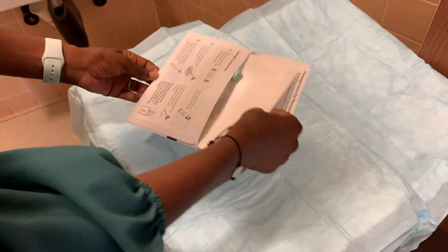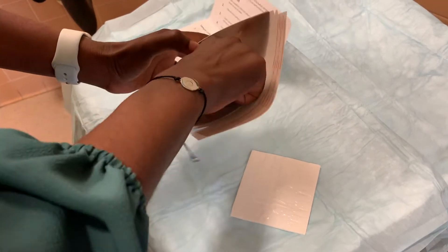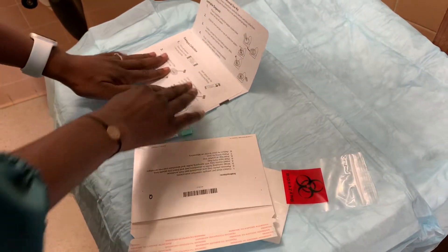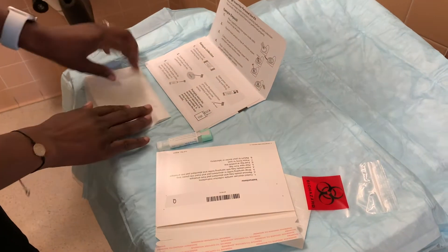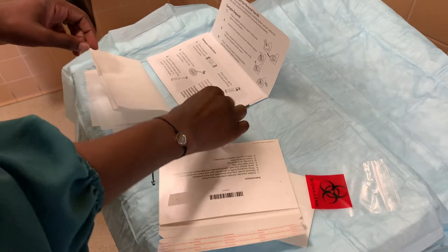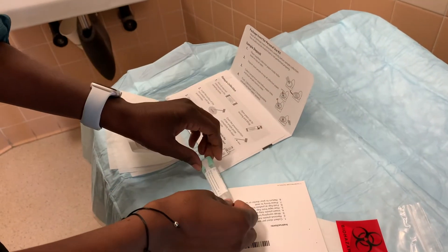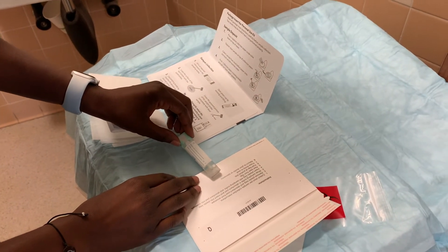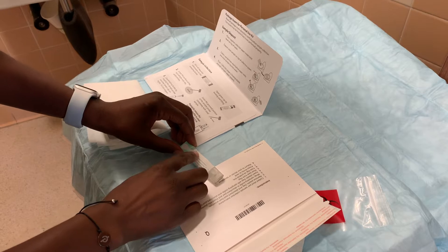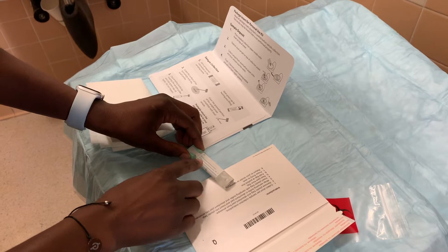When you get it, you'll want to open it and take out all of the contents. Then you'll want to take this container and write your name, your date of birth, and the date you're collecting the sample.